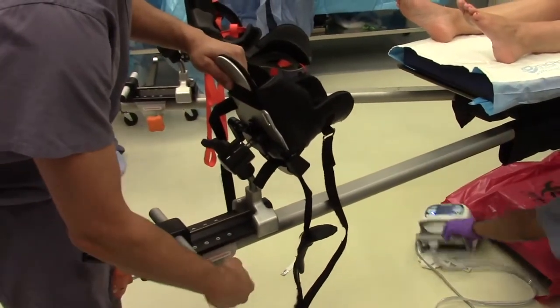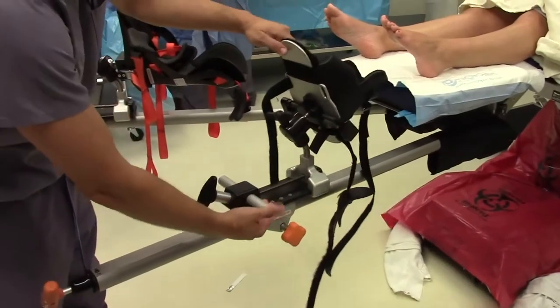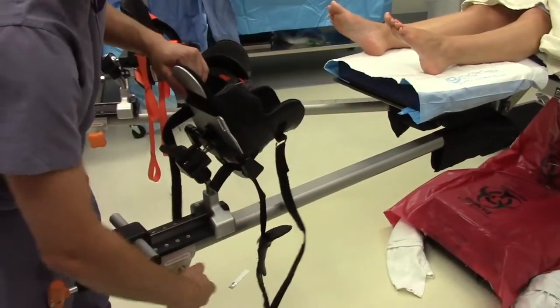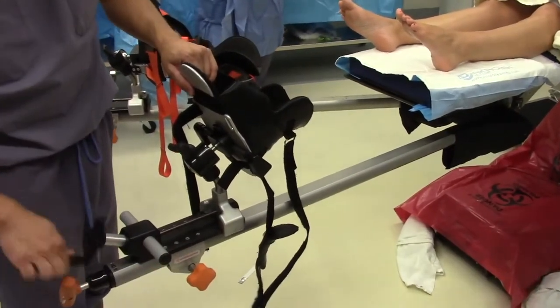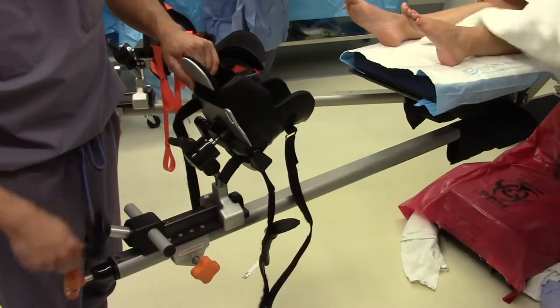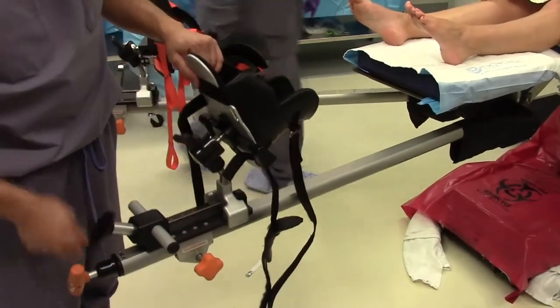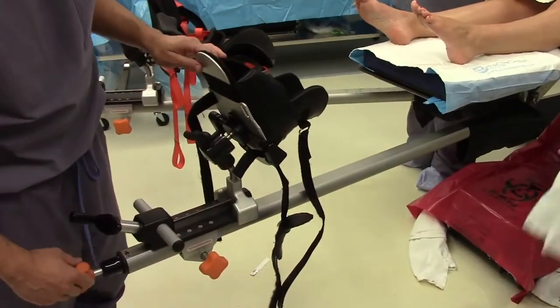The gross traction is this orange knob on the side of the apparatus, which allows me to freely move the boot proximally and distally. Ensure this is completely locked before utilizing fine traction, which is this knob on the end of the apparatus. By spinning this, it turns a crank which applies smaller amounts of traction to the boot. Utilize this frequently during surgery to apply varying degrees of traction safely.